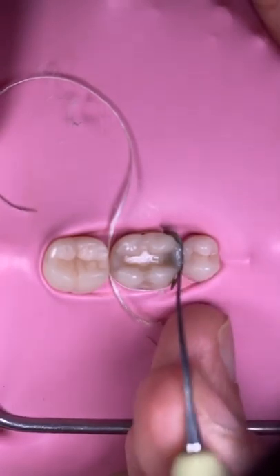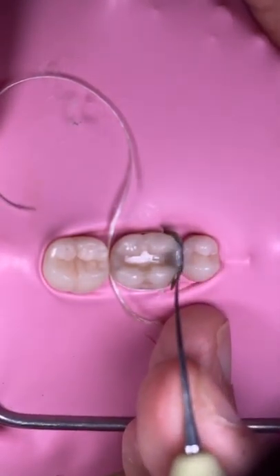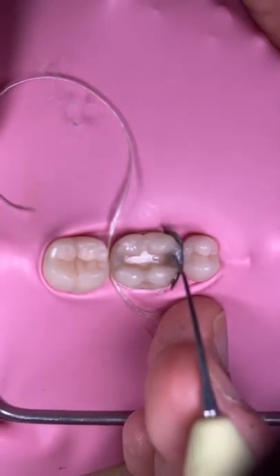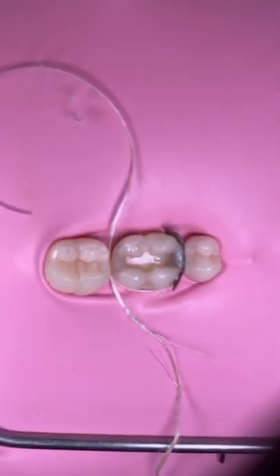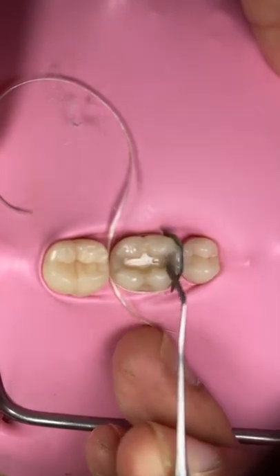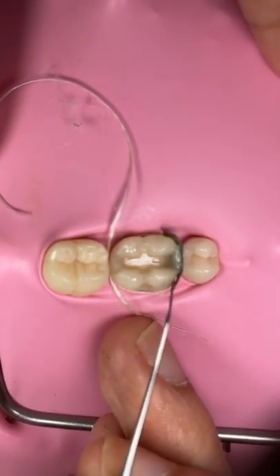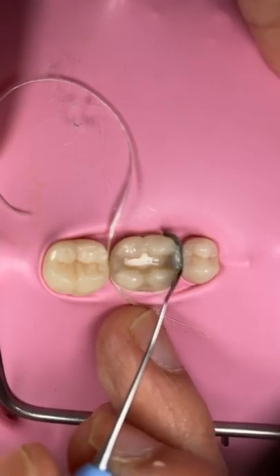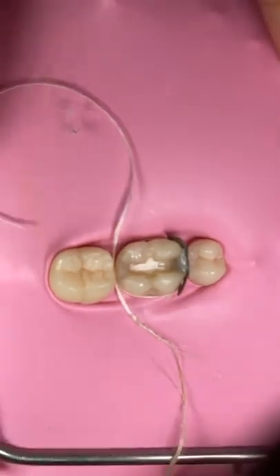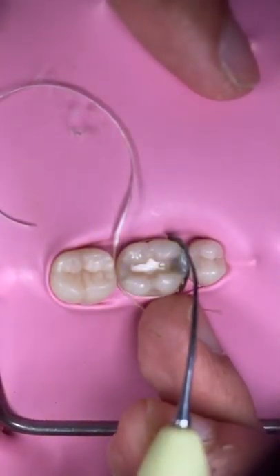Okay. Excess is your enemy. I mean excess on the proximal. Yeah, but actually it's better to have excess, as long as you can reach the excess so that you can make it round after the finishing, or when you do polishing or finishing.